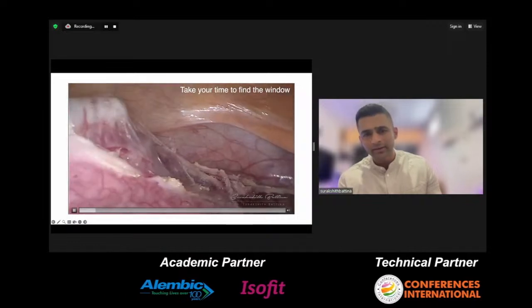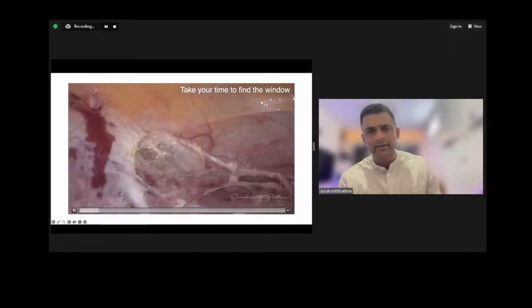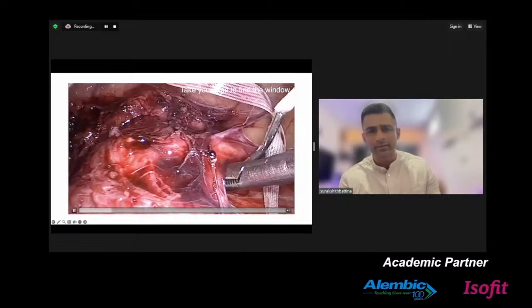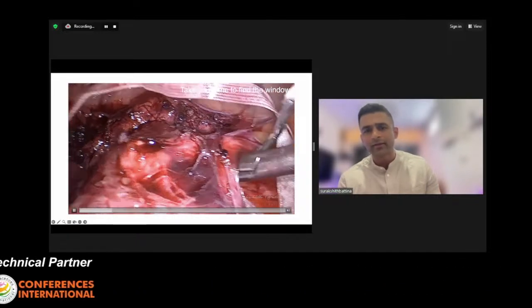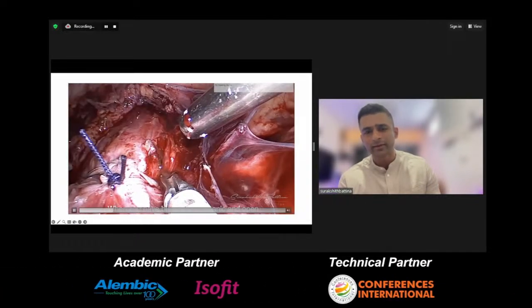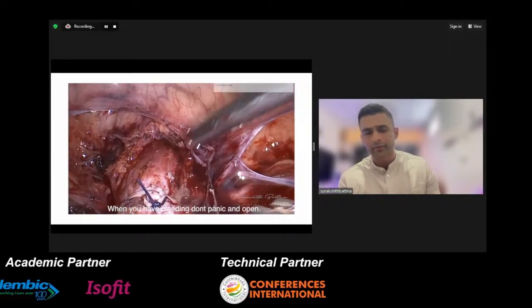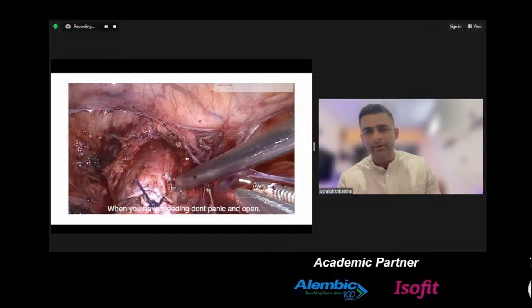Since I did close to, I think, 48 cases right now, we did encounter some bleeding, so I will be showing you what happens whenever bleeding is there. So as you can see, we did have small bleeders in one of the cases like this. So you can just go ahead and bipolarize it. Nothing is going to happen, so you don't have to worry too much about it. Bipolarizing is not going to cause anything.